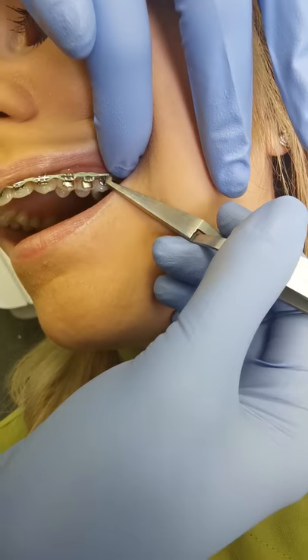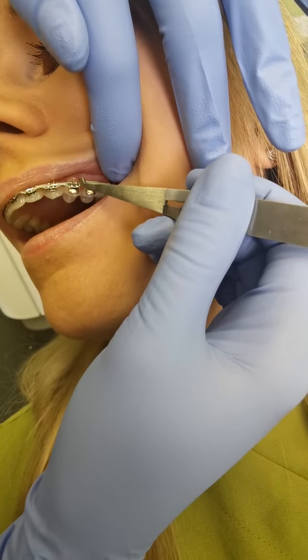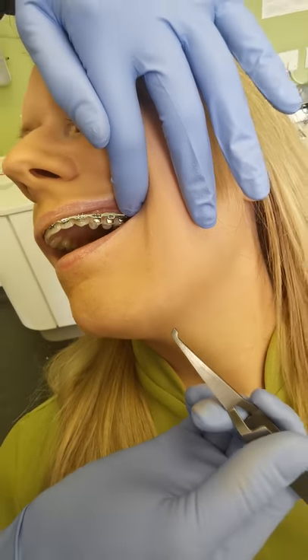If you can't do that, the best thing to do would be to snip it as close as you can to the bracket with a pair of scissors, if you can do so safely.